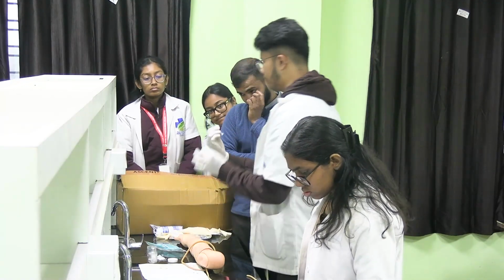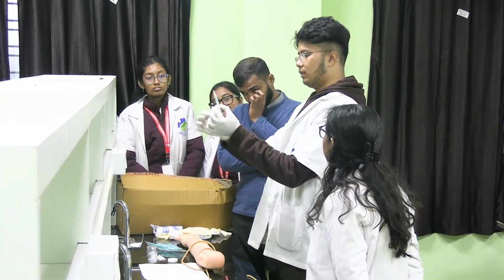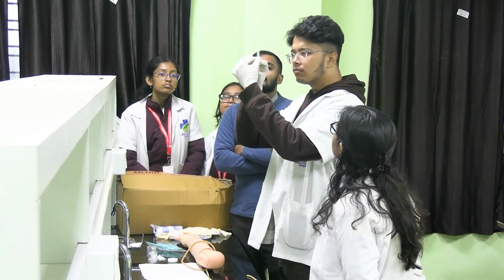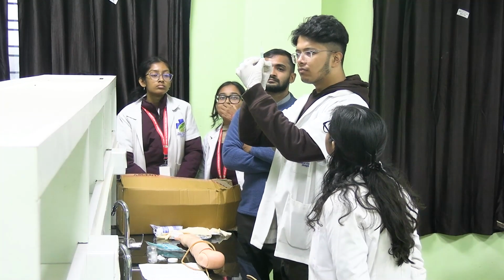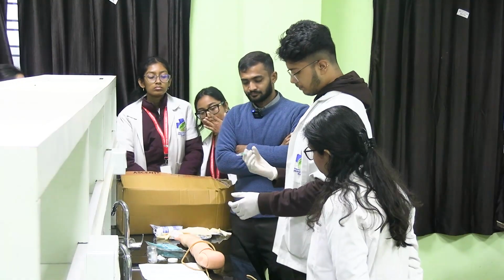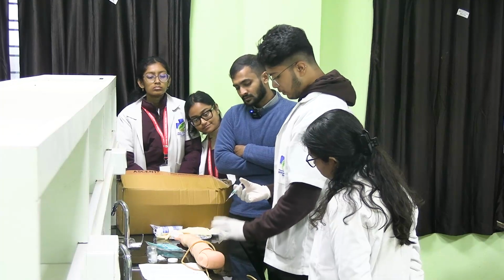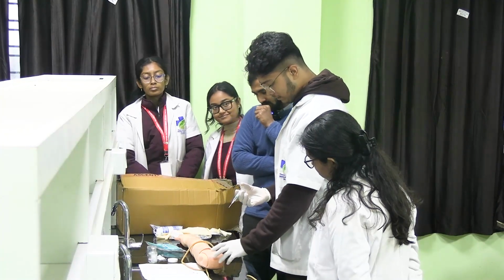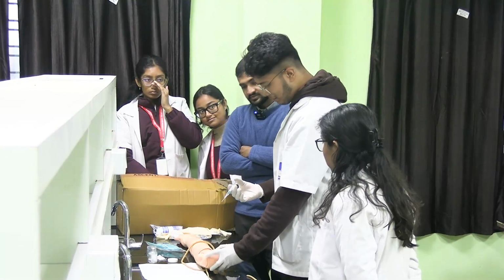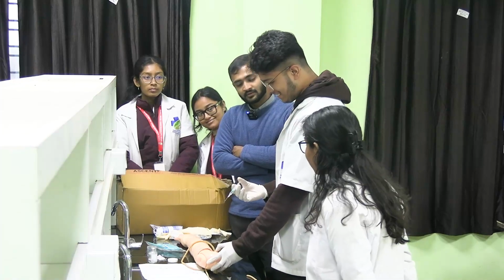Then I will make sure there are no more air bubbles, sir. Then I will remove the extra part, sir. Do it. 1.1. I'm done, sir. Then, since I'll be doing the intramuscular, sir, what is the technique for IM? Z track technique, sir.